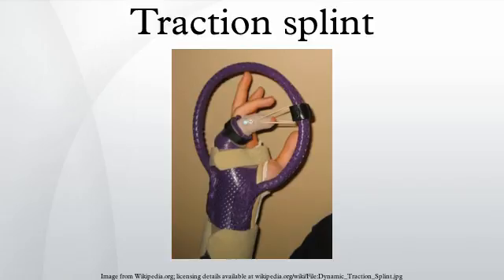The CT6 was introduced in the 21st century and utilizes a 4-1 pulley system to achieve precise and powerful, when necessary, traction. This splint is built with carbon fiber tubing and weighs 500 grams. In 2003 the CT6 was chosen as the splint of choice by the U.S. military and currently has over 30,000 in the field. Its compact and light design, along with its greatly improved traction method, has greatly enhanced its popularity.